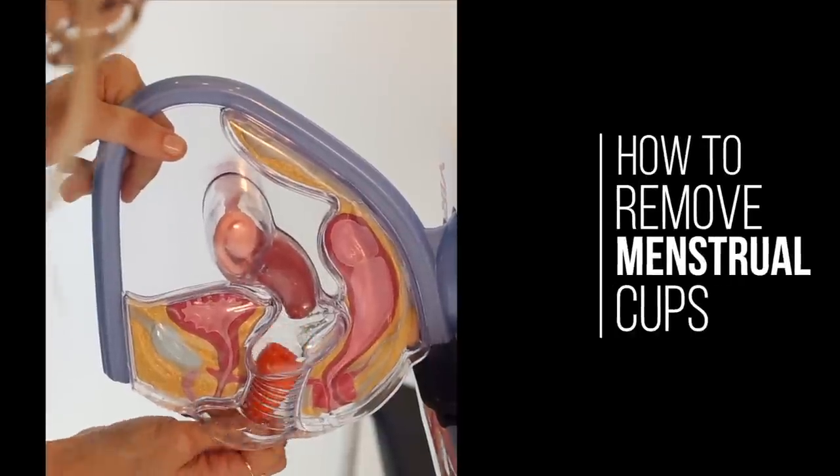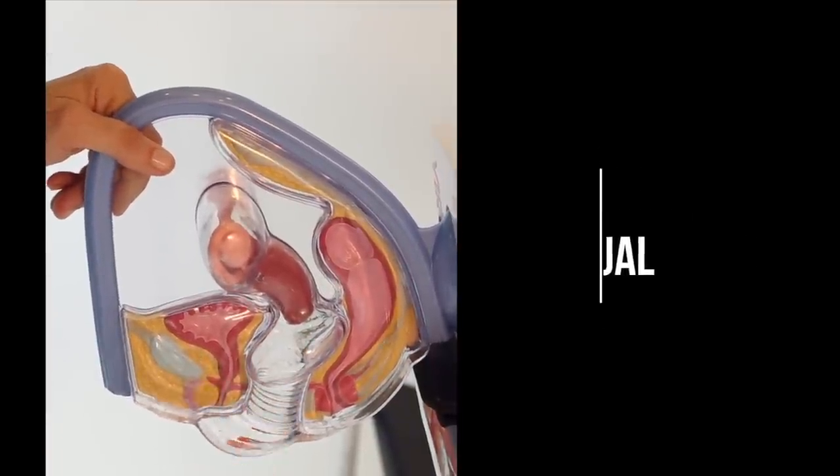You put your menstrual cup in, and now it's time to get it out. Put a cup in it, it's going to help. Not literally — we're not actually coming over to your house and removing it, like you might have seen in some movies or TV shows.